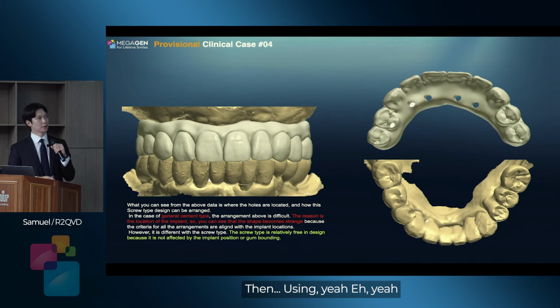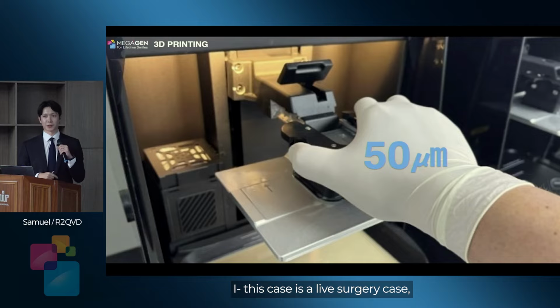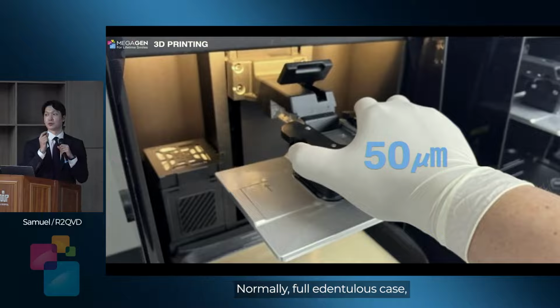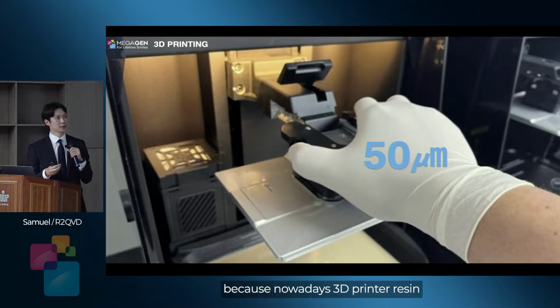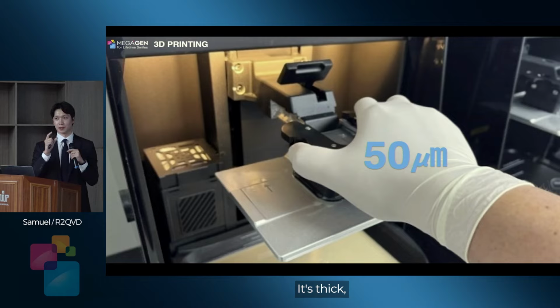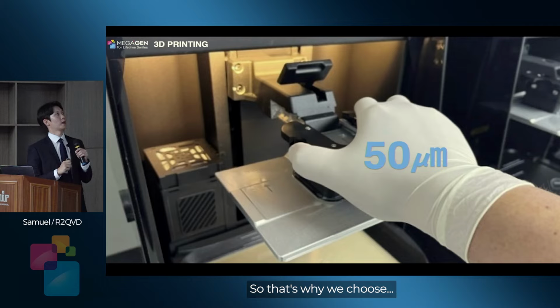This case is a live surgery case, so we don't have any option. We cannot mill. Normally, for an edentulous case, the milling time is over 2 or 3 hours. So we're using the 3D printer. And it's okay because nowadays 3D printer resin is very good. And also for the Oron X case, especially an edentulous case, the thickness is not thin, it's thick. So it is strong enough for the arch. So that's why we choose the 3D printer.